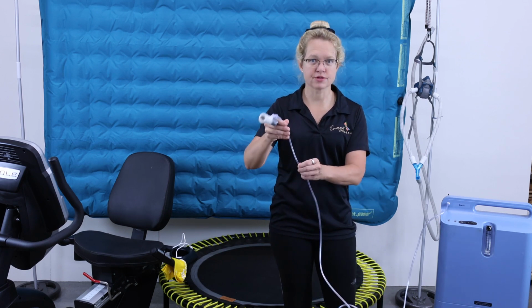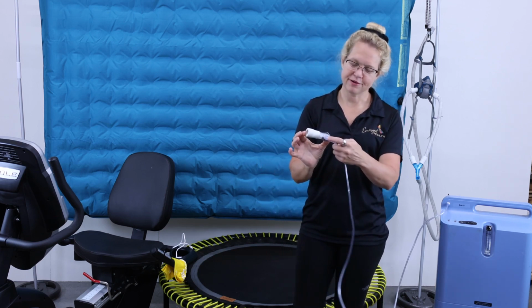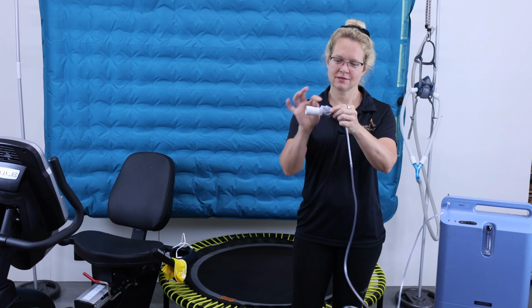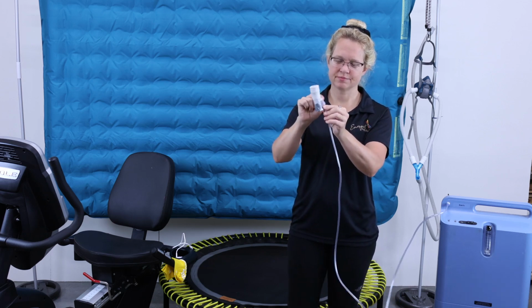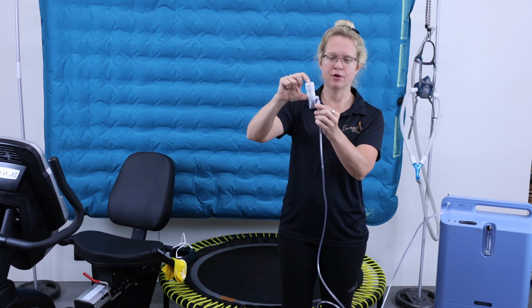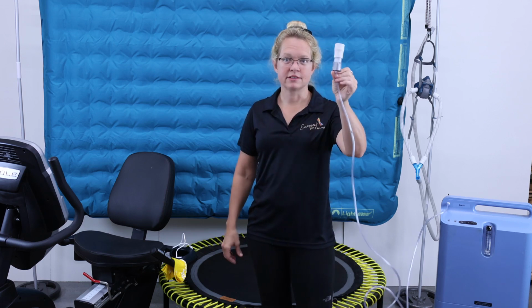You can buy them on Amazon, and then I modified it with a little Y thing, or a little right angle piece that I bought online for CPAP machines, and then I put a CPAP hose end on it. So I sort of made my own little jerry-rigged attachment.